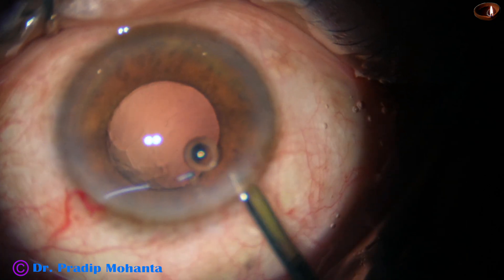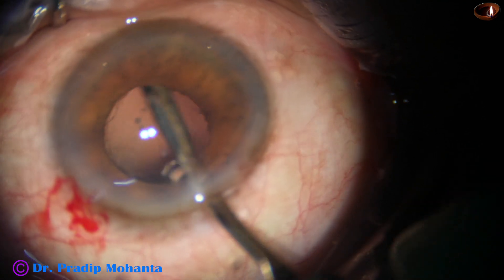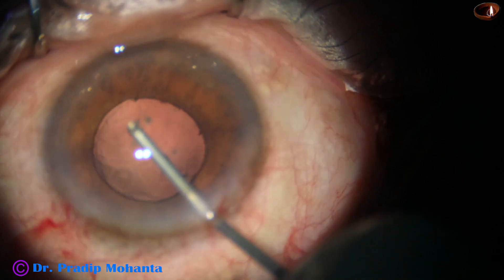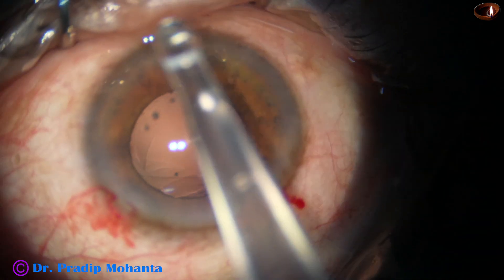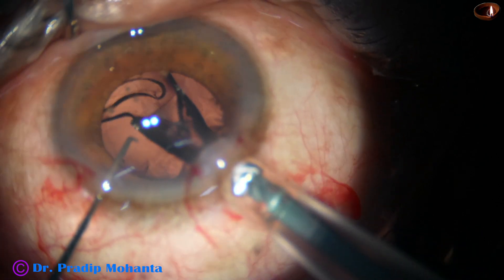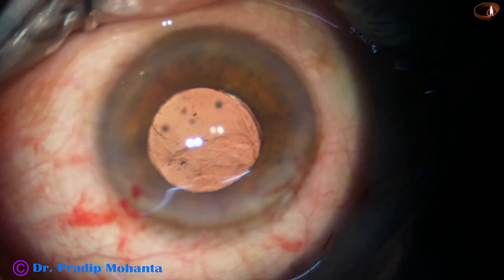These fibers are covered under the iris. I took the Simcoe and attempted to remove them, but the iris was coming in the way. I injected viscoelastic because in floppy iris syndrome, if we try to hydro-implant the IOL, the iris may suddenly come out through the main wound. And if we rub the eye with the eye sponge, there is a chance of iris stromal atrophy.